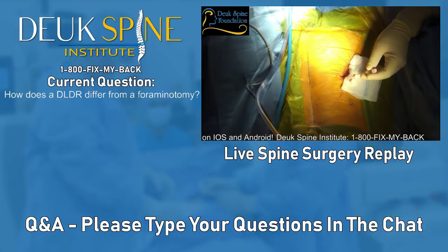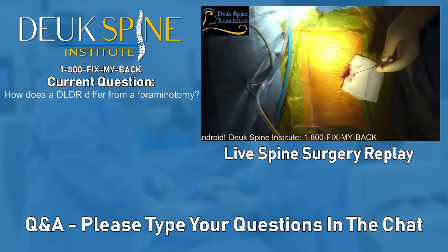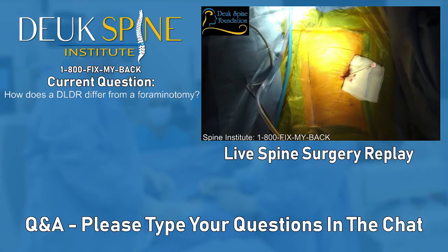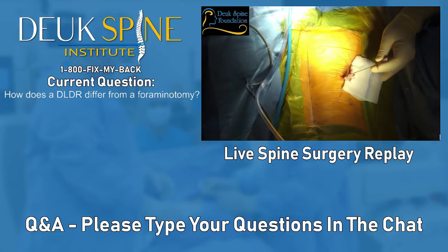And that's why I do that procedure on every one of my fusions. Because if you don't do a wide decompression in the foramen and lateral recess, you risk the patient waking up with leg pain that they didn't have before, or not getting rid of the leg symptoms they had before. That would be catastrophic, especially since it's a fixable problem. Now you fuse them with screws, rods and cages, and there's no way you're going to go back and do that afterwards.